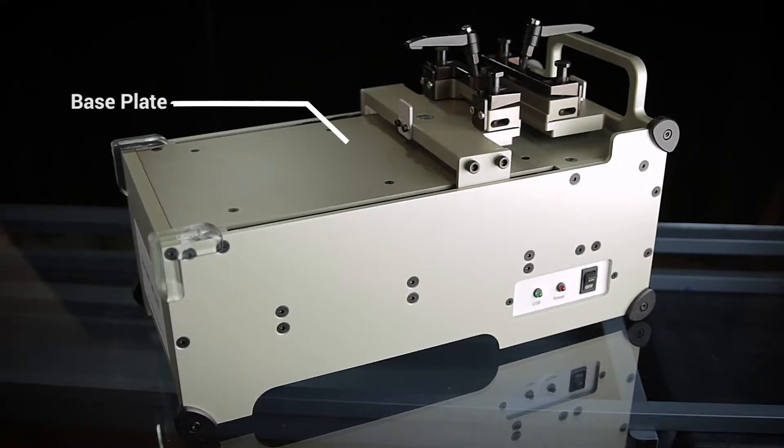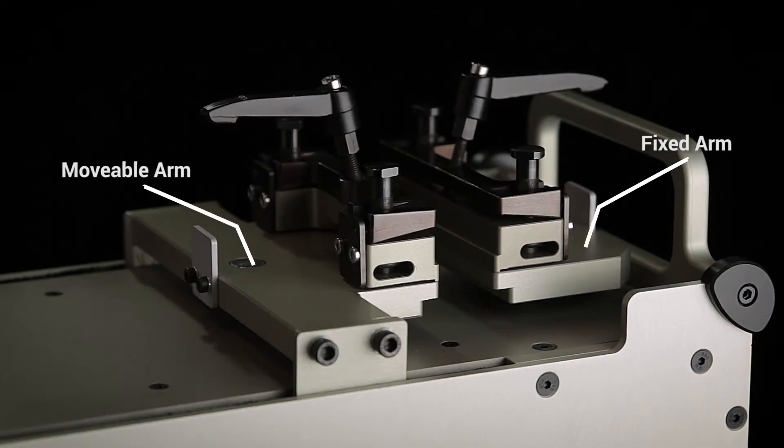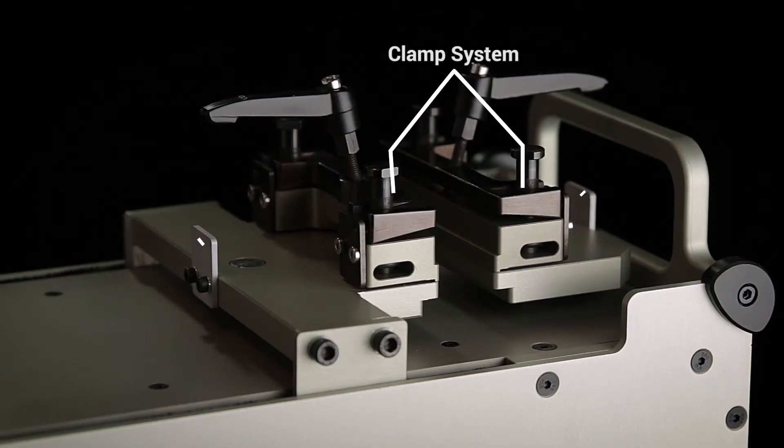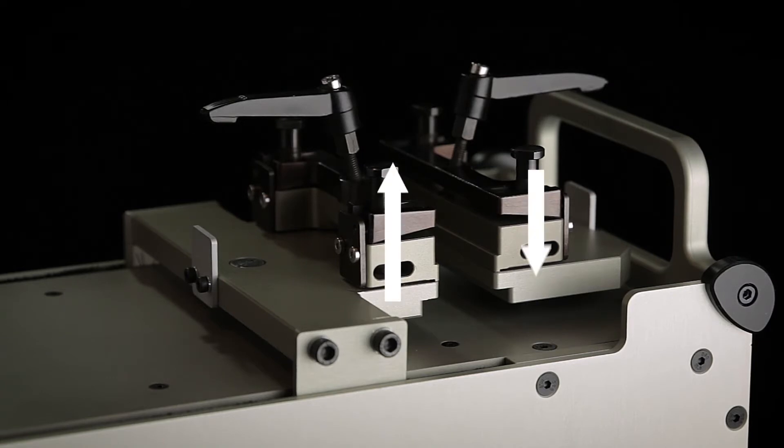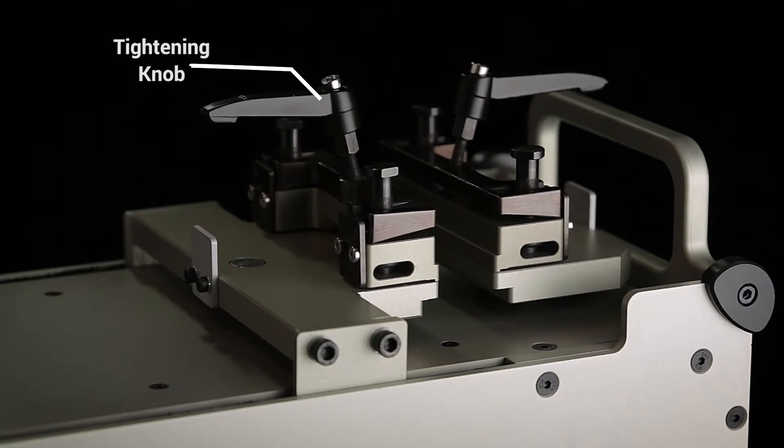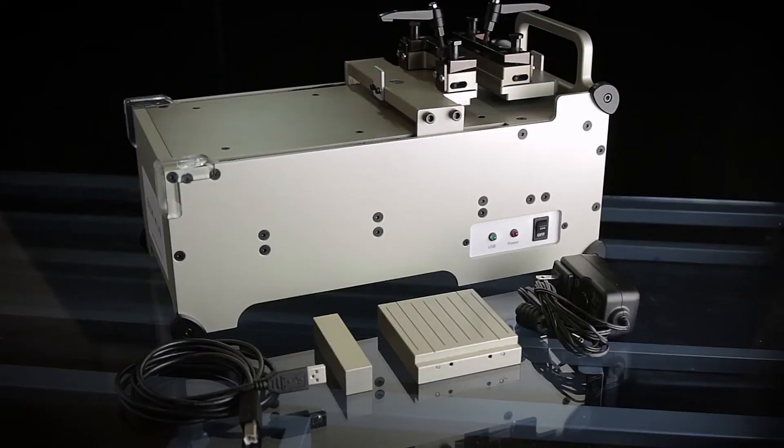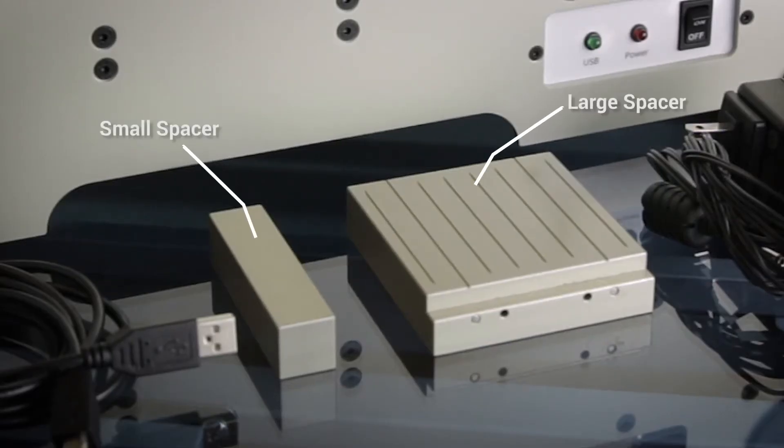The base plate houses the movable arm and the fixed arm, each with their own clamp system and stopper. The clamp system consists of a clamp that operates by sliding up and down and a tightening knob that operates by winding the handle. There is also a large spacer and small spacer which are used for the short and long segment tests in the testing sequence.